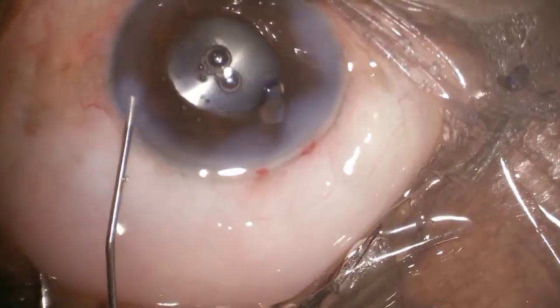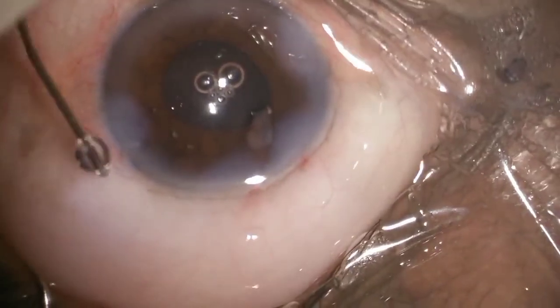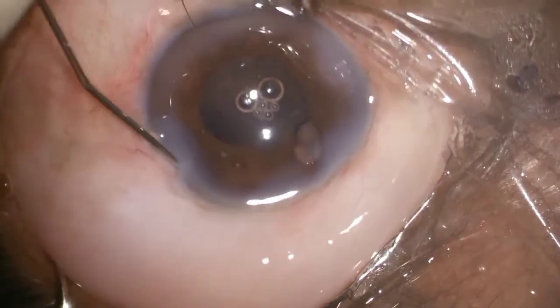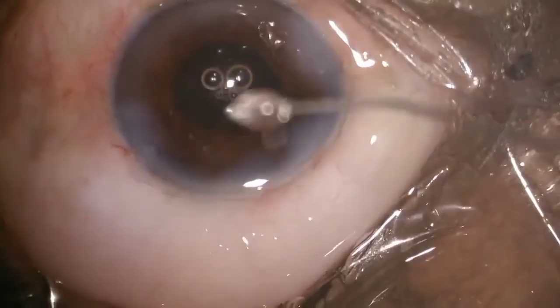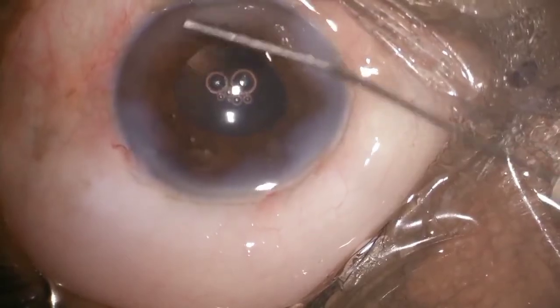After sealing the second side port, the AC was well formed, no problem. But the epithelium, as you can see, at the main port was a little eroded. So I repositioned it back, and the case was closed.